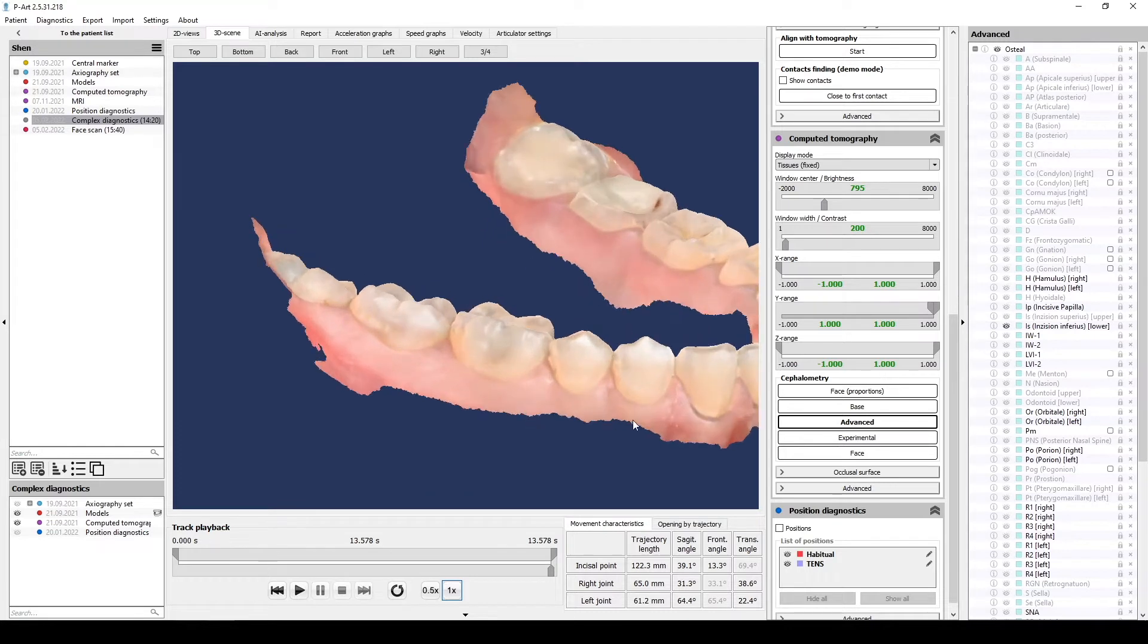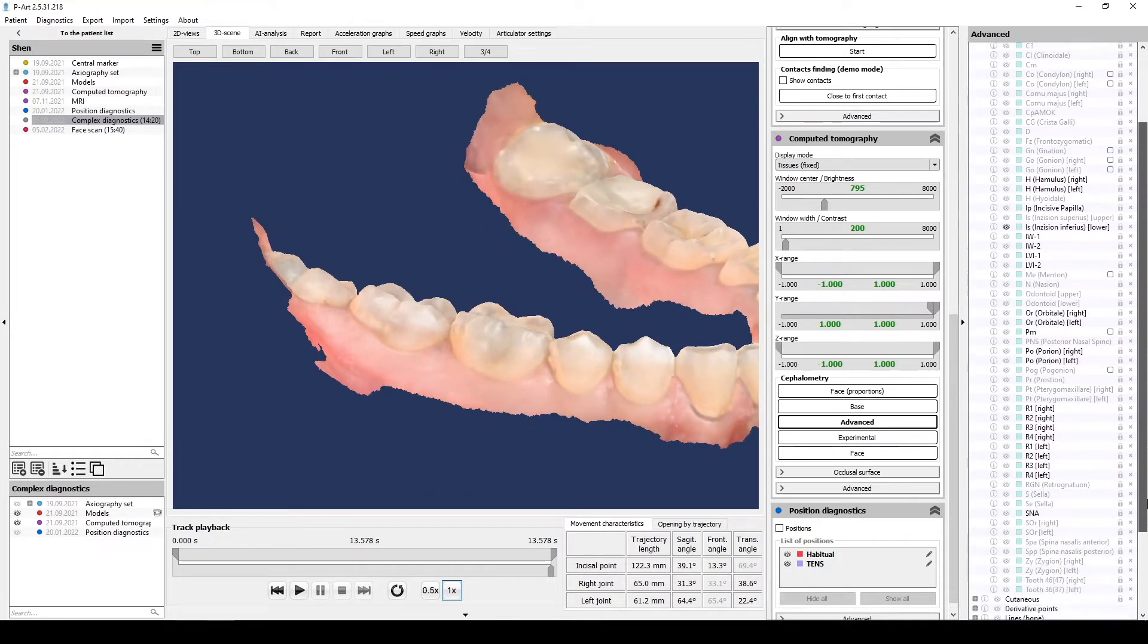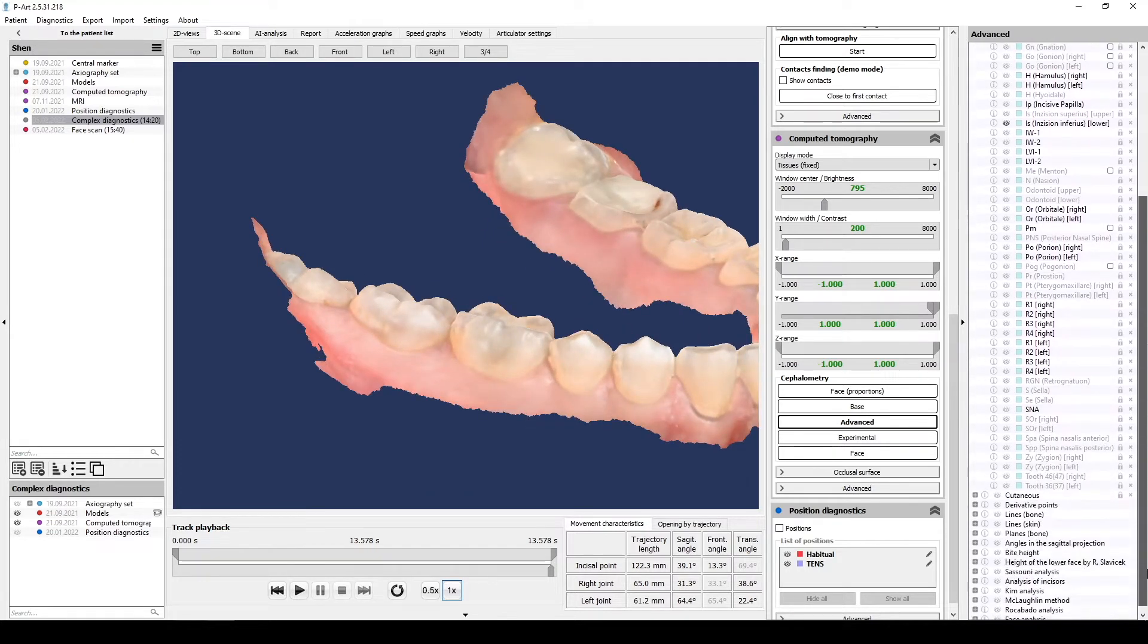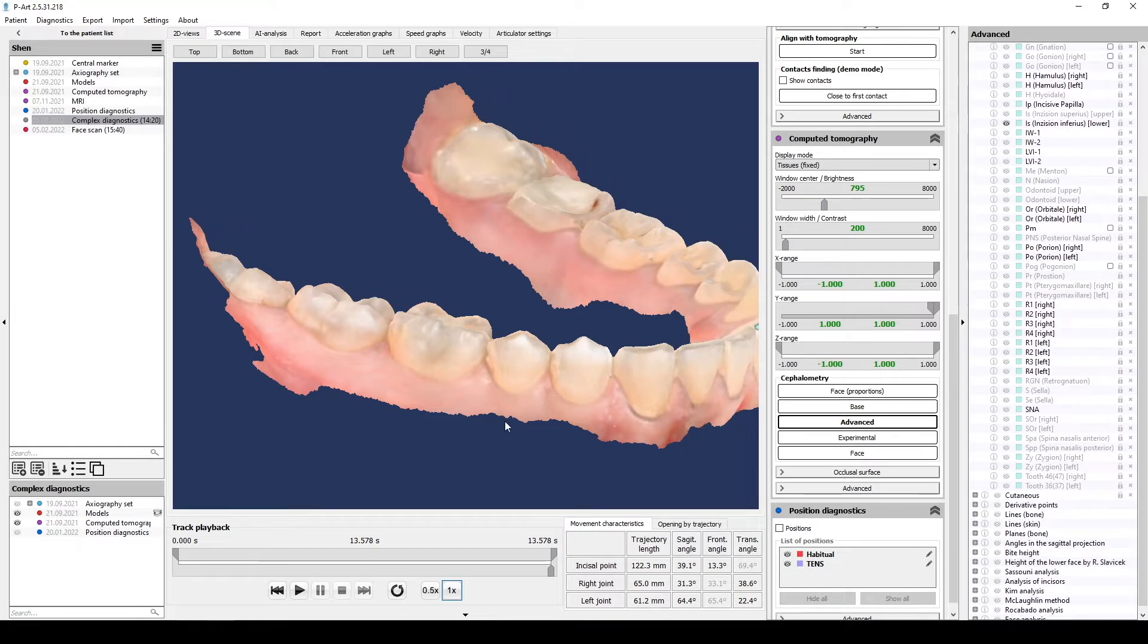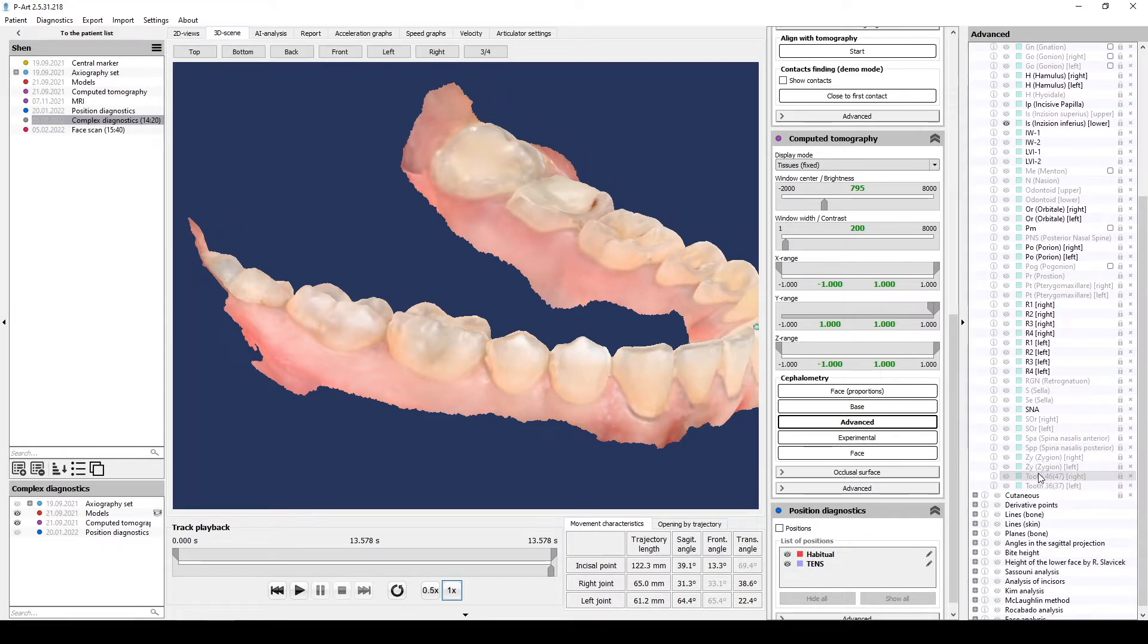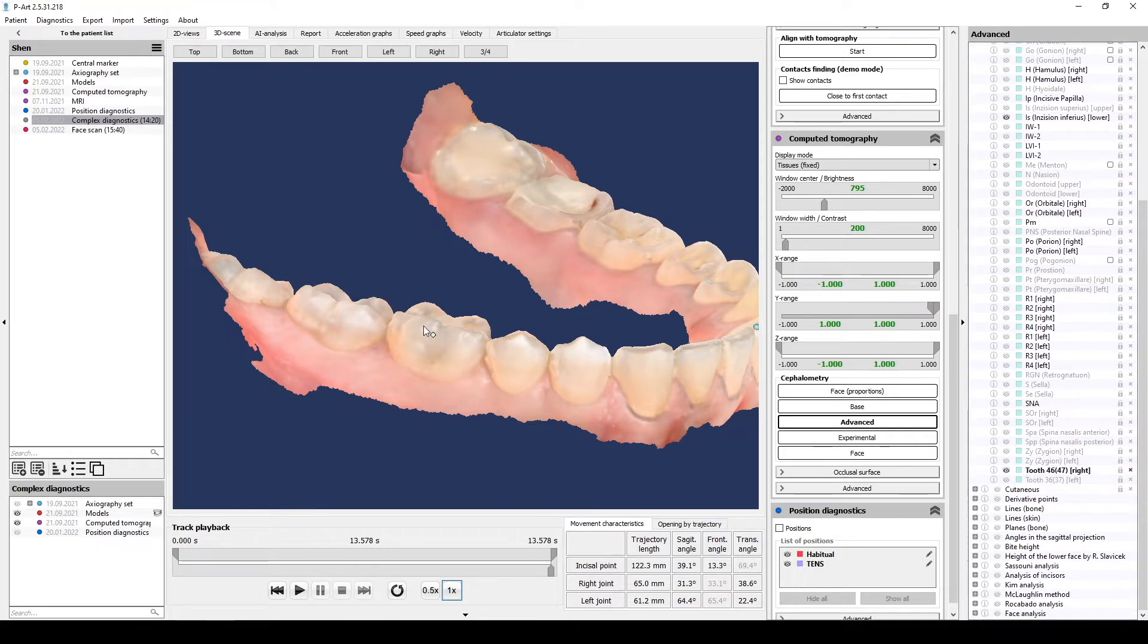Next two points will be placed on molars, they are in the end of the list, osteal. Put first point on the molar 46 or 47 then put point on the molar 36 or 37.